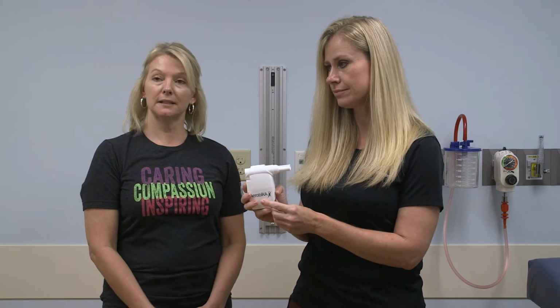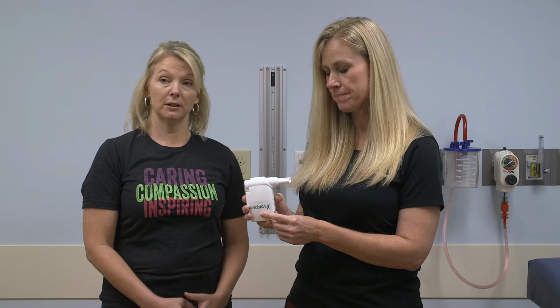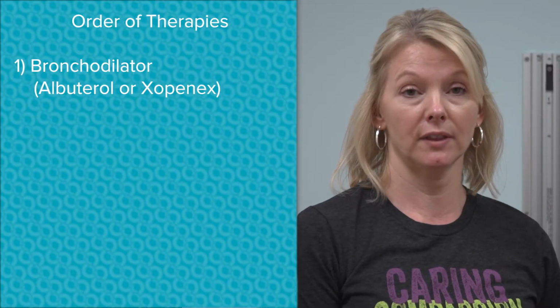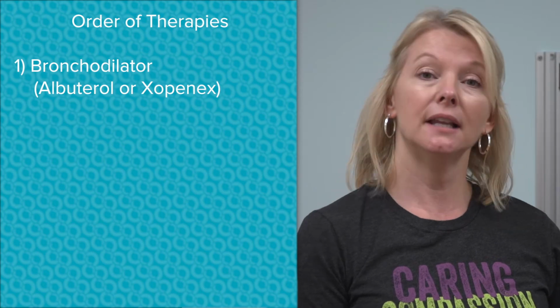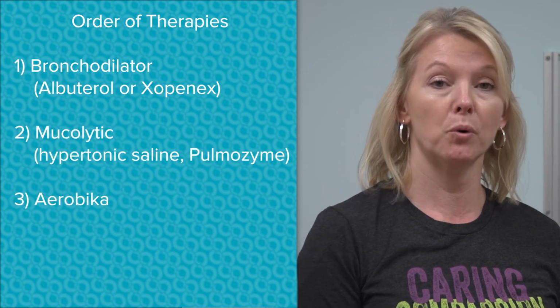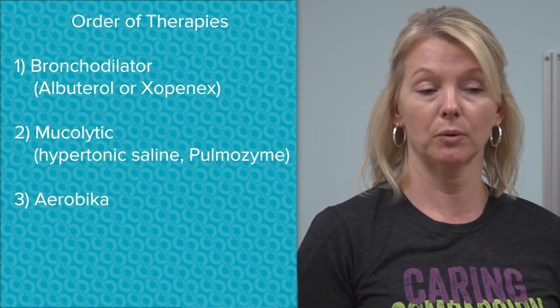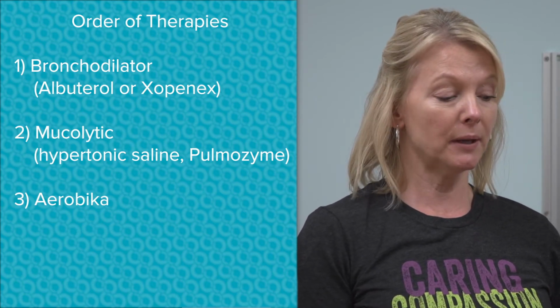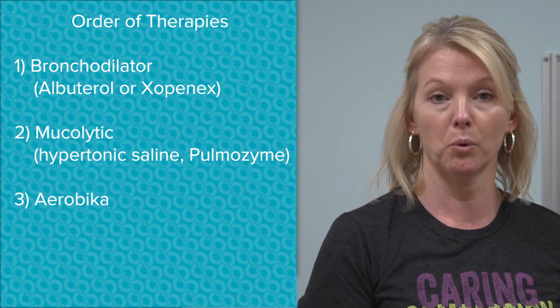So just to touch base a little bit on the medications that we run during an Aerobika treatment, we're always going to start, if they have a bronchodilator ordered, that's going to go first, their albuterol, and then any mucolytic, of course, would go before the Aerobika. So your Pulmozyme or your hypertonic would always go before this. We typically don't run the medication through here, they just do the medication before.